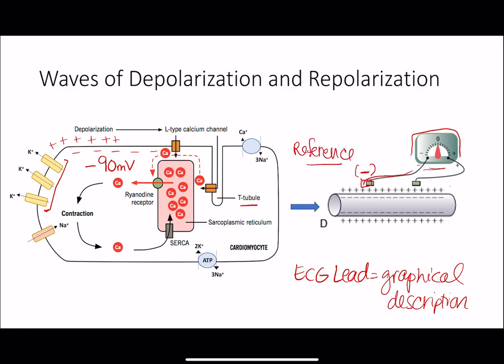And we call it the reference electrode, but in the EKG, this could actually be physically 2 to 3 electrodes. We'll get into that, but they would be categorized as the reference electrode. The other side, right, is our positive. Our positive is called the exploring electrode.